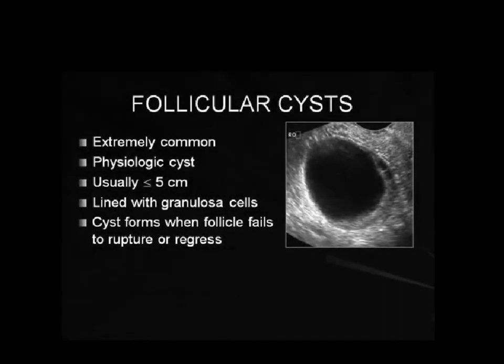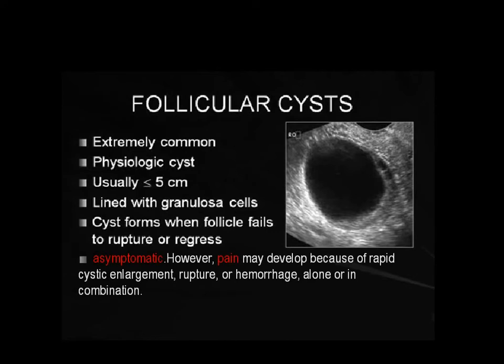Functional or follicular cysts are extremely common. They are physiologic, usually less than 5 cm, lined with granulosa cells, and form when the follicle fails to rupture or regress. As the follicle grows, the LH surge occurs but the follicle does not rupture — it remains intact and continues to enlarge. Usually asymptomatic, pain may develop because of rapid cystic enlargement, rupture, or hemorrhage. This is a functional cyst — it looks like a simple cyst with clear contents.